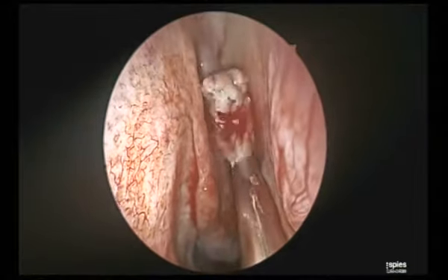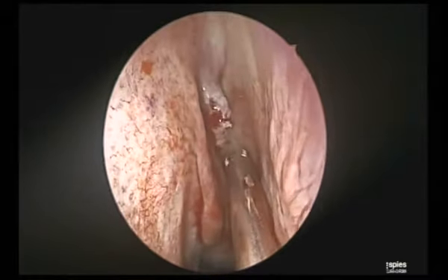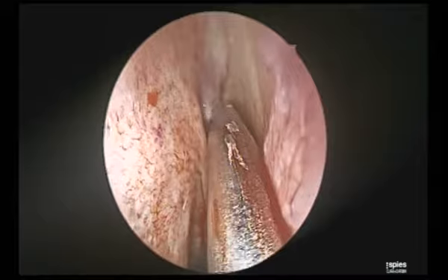Oh, it looks like a stalk and the skull base there. Oops, CSF. No, sorry.